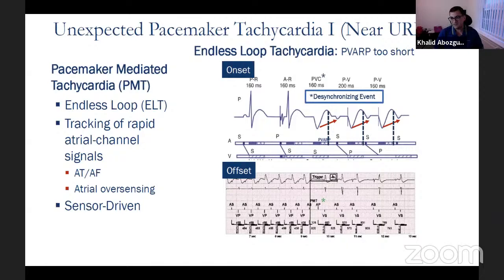Because the quality of the images, especially for a cardiac MRI, may be doubtful. But in my view, the first thing I will do is pick up the phone, call my pacing clinic, ask for the lead details and the device details, and then check if they're MRI compatible or not. And that's my view. I don't know if anyone has any comment.